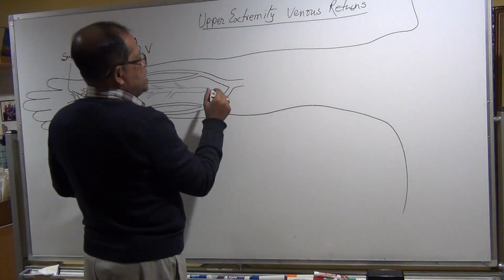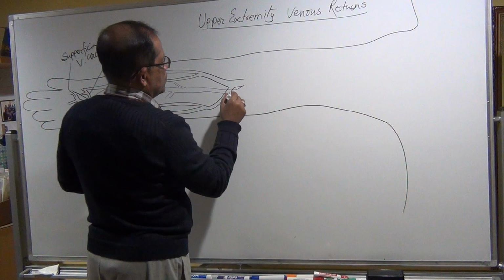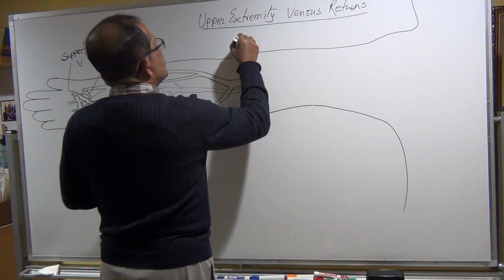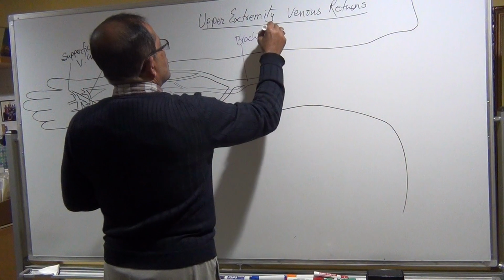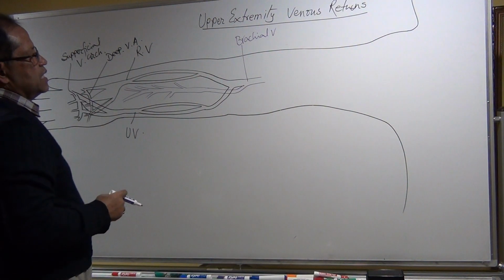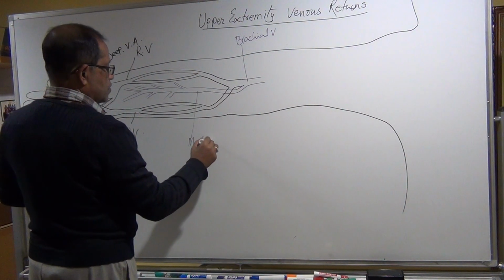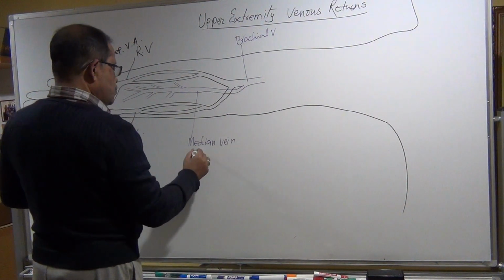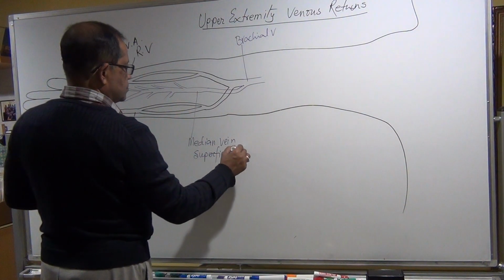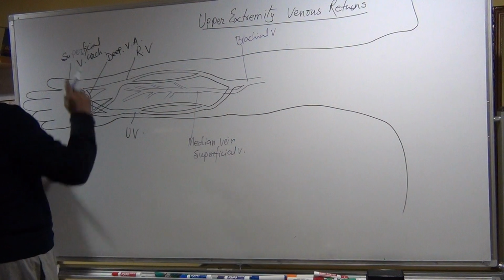This is the median vein, and the median vein also joins with the brachial vein. Okay, so this is brachial vein. So now brachial vein, ulnar vein, radial vein, these are part of the deep veins, but this median vein is a superficial vein. Okay, sorry, superficial vein.